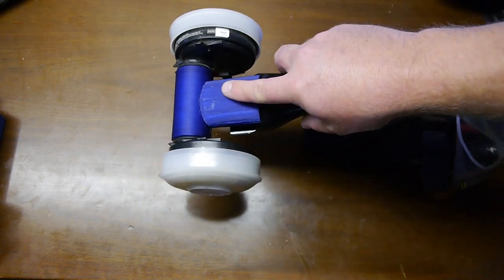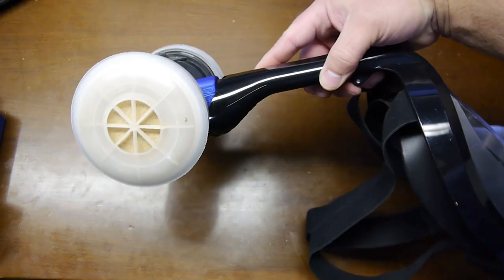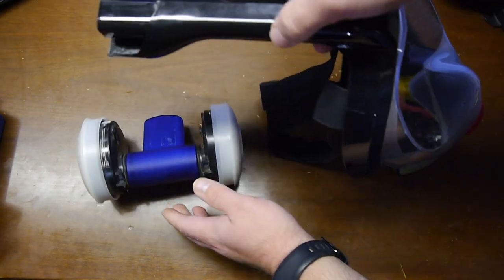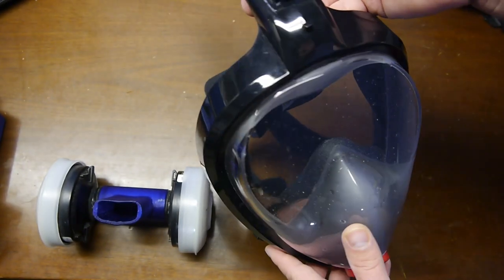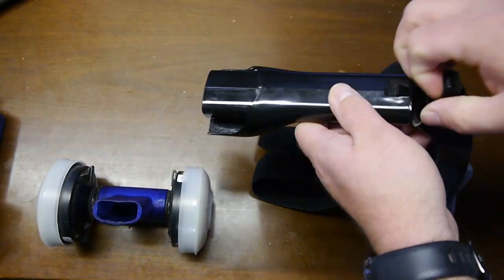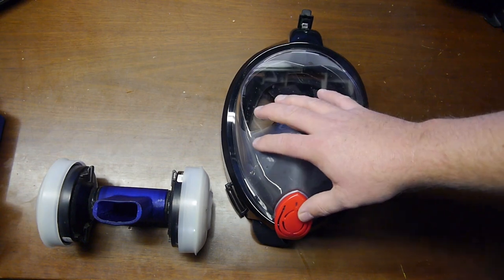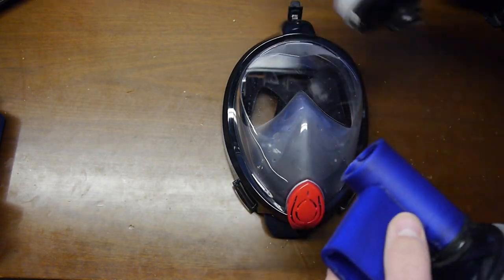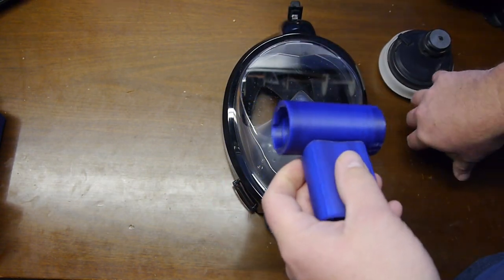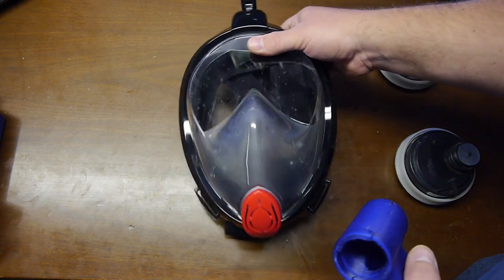So I'll put this on Thingiverse, but will that work for everyone who has one of these? Probably not. I'd have a hard time believing that the manufacturers of these masks would have kept this same cross section throughout the years. You might get lucky in that this is the model I have. They may have kept it, who knows. It may have been cheaper to keep reusing the molds for these instead of updating them. But what I'd like to do is just show you roughly what this is, the idea, the concept behind it, and then you can work with a local modeler or 3D printer to make this based on the availability of this and this potentially in your area.